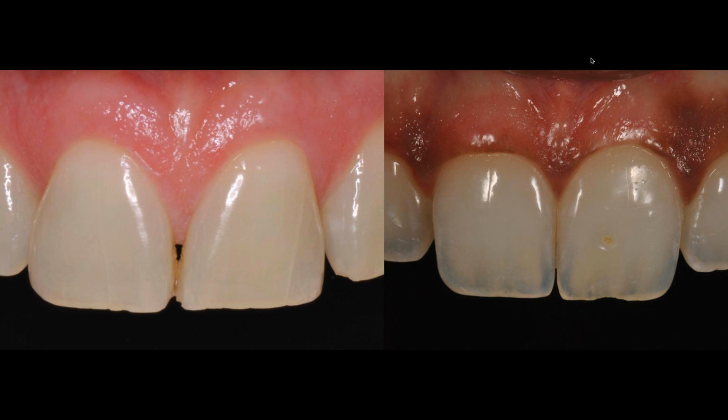So just to put this into perspective, on the left side ring flash, on the right side dual point flash, and we all can agree that both photos are really good quality, but there are differences in each of these photos. The one on the right shows more detail. The one on the left is good quality, but with less detail.